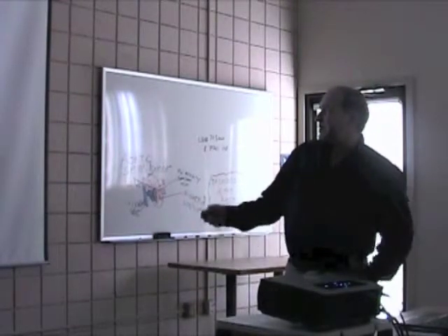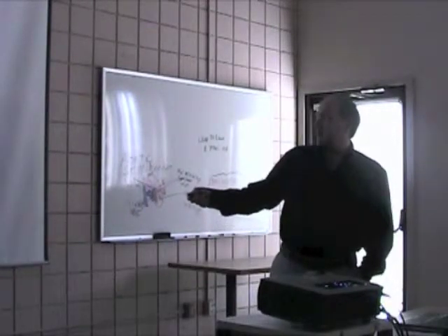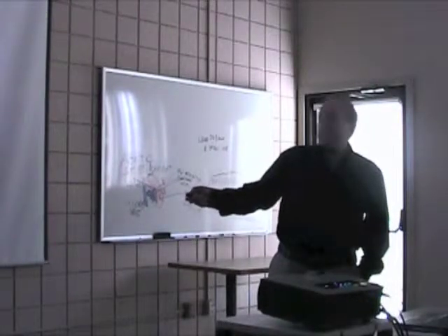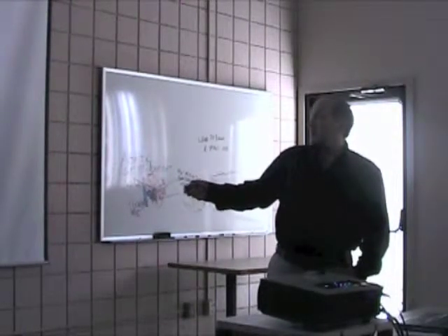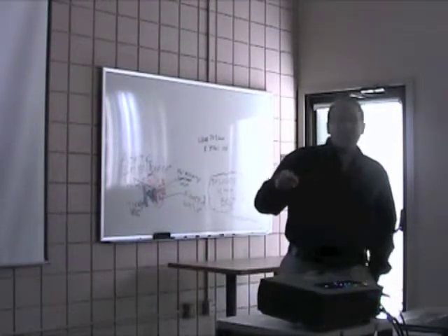This is a stentless valve. This is actually a pig aorta. So this is from a pig. This is the aorta where it comes out of the heart. This is the aortic valve here, and this is where the coronary arteries feed the heart itself. So what they do is they cut this out of a pig, they tie off the coronary arteries, and they put a piece of cloth on here to make it easier for us to sew it into a human heart.